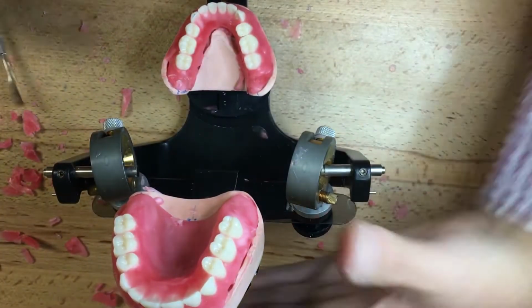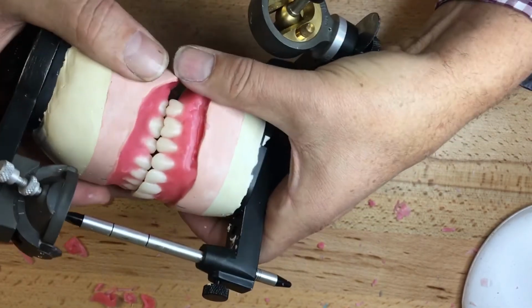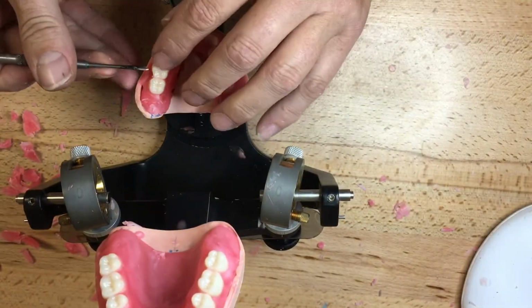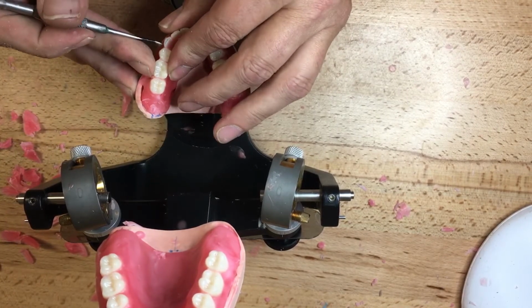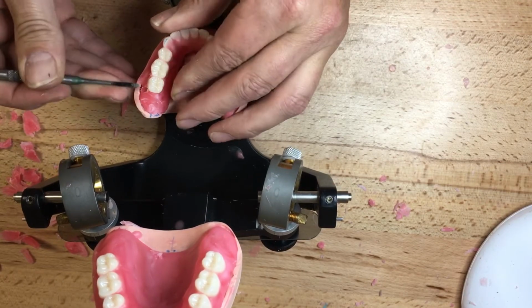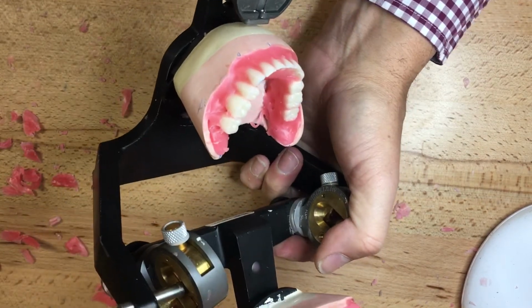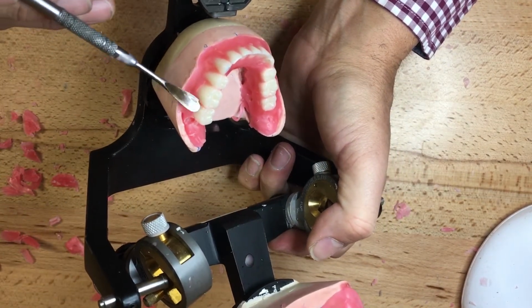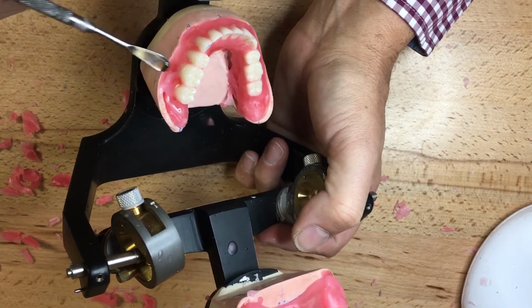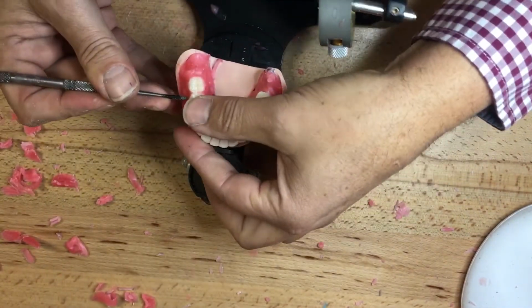So I'll go ahead. Oh, I should check the other side. I'm sure it's identical. Yes. And then balancing contacts, same thing, kind of close. Kind of close. So I'm going to elevate the distal of 6, 7. Try not to incorporate too much Wilson curve or Monson sphere. I don't think it's necessary unless we're doing a 0-degree setup. Then we can introduce more of the curve of Wilson into our denture setup. And then I'll do the other side.